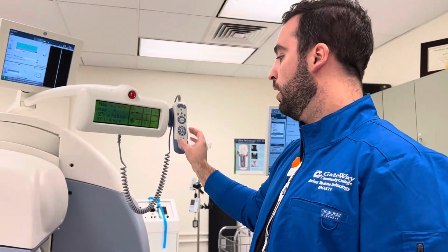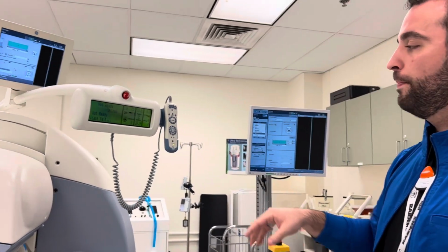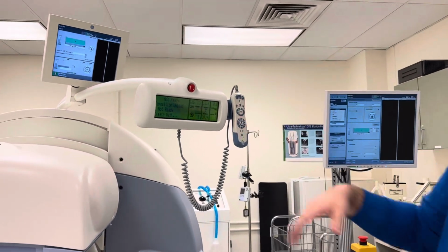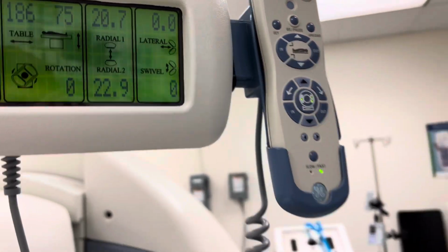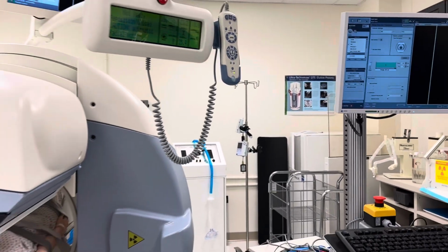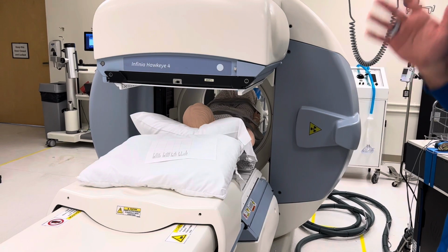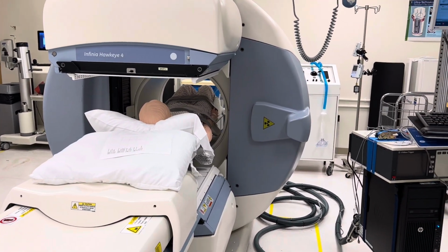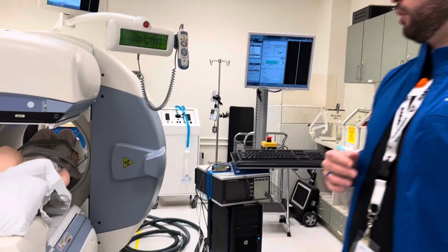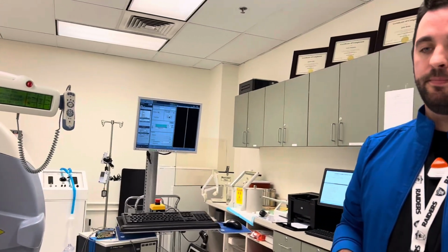Once the images are done, we're gonna tell Rosie, okay, Rosie, we're all done. We're gonna get you out of the camera now. Again, enable, unload. And then it's gonna bring the detector heads away from the patient and retract the patient table and bring her all the way down to the ground. And at that point, you'll help Rosie get up. She'll pack her things, put on any of her belt or glasses, whatever she took off for the scan, right? And then we'll be all done with the whole body acquisition.